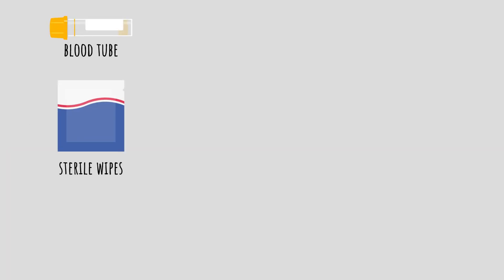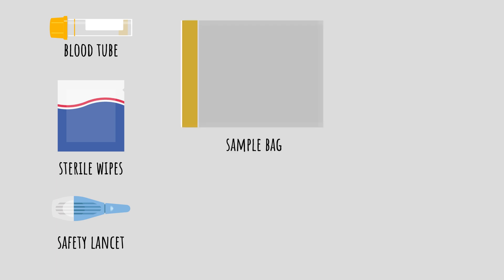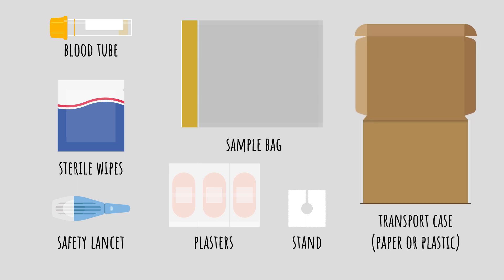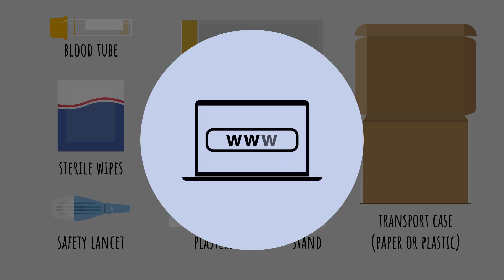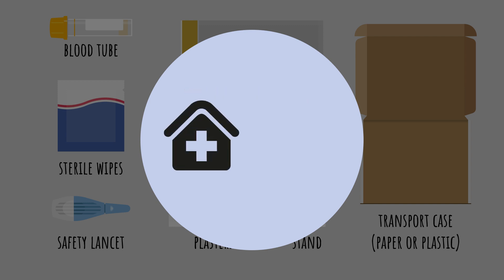Your kit includes a blood tube, sterile wipes, a safety lancet with a small hidden needle to prick your finger, a sample bag, plasters, a tube stand, and a transport case. Your kit may look slightly different from this video. If you have any questions, check your local sexual health website or contact your local clinic.